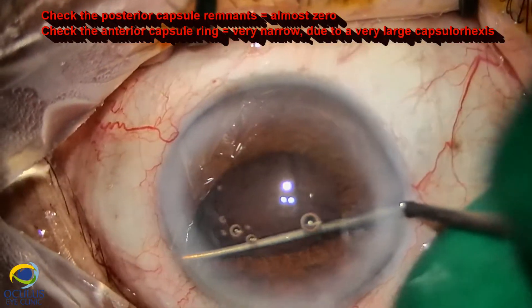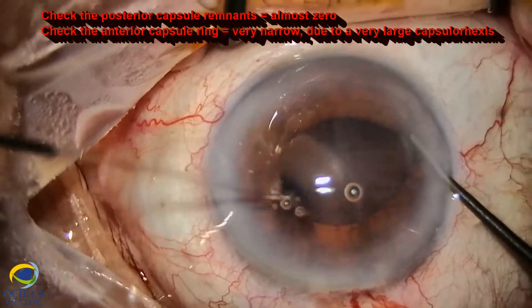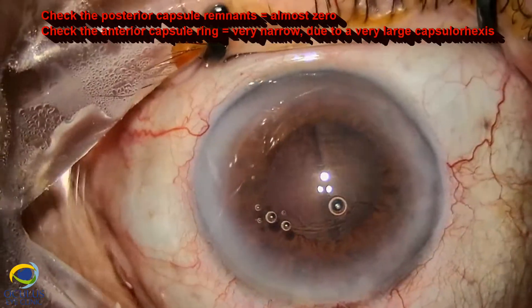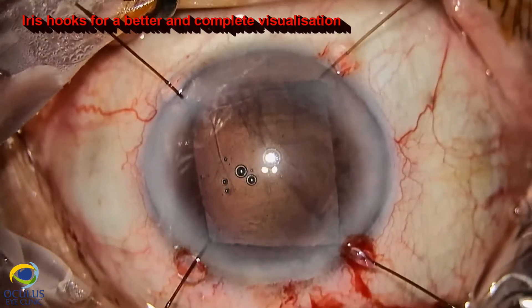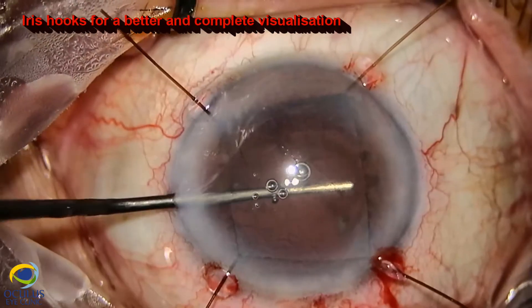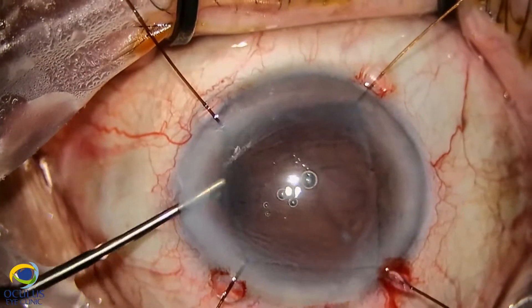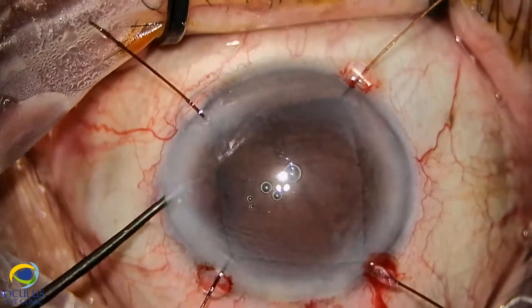The posterior capsule was almost gone — a large break in the posterior capsule. At the same time, we noticed that the anterior capsulotomy is also very large, so we have only the peripheral anterior capsule to serve as a support for our future IOL.